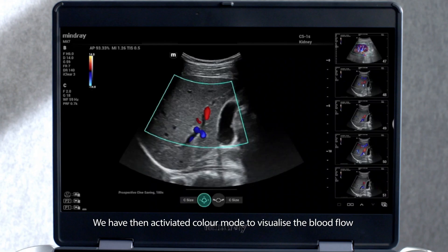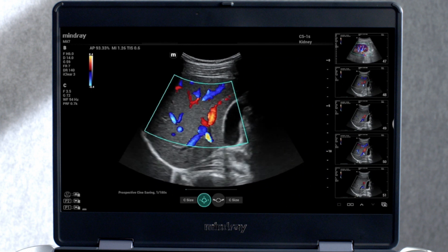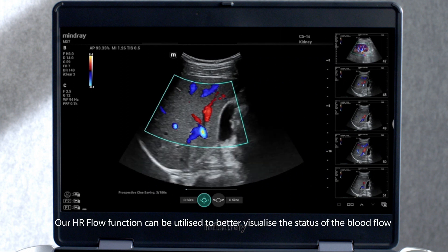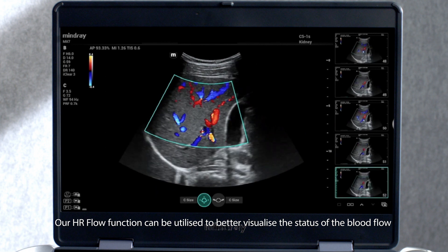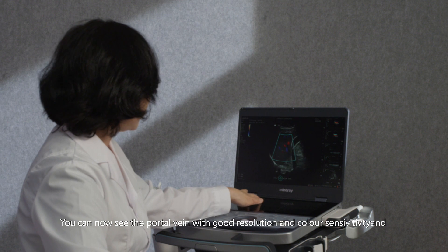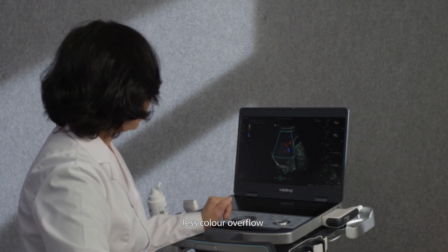We have then activated colour mode to visualise the blood flow. Our high-resolution flow function can be utilised to better visualise the status of blood flow. You can now see the portal vein with good resolution and colour sensitivity, with less colour overflow.